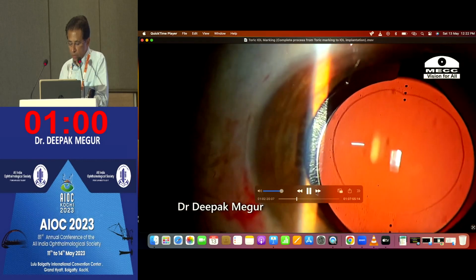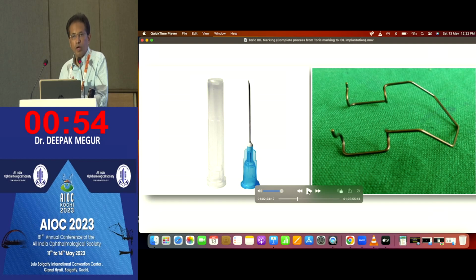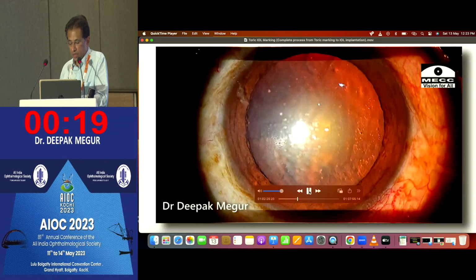The most important aspect is, in certain situations, like in patients who have myopia, who have a large bag, those are the situations where I would use a CTR. The idea of using a CTR in these eyes which have large bags is, one thing, it stretches the bag and brings the posterior capsule forward a little bit. The adherence between the posterior surface of the lens and the capsule is much earlier and stronger, and that's the reason why the chances of lens rotation are slightly minimized. So watch out for the eyes which have bigger white to white ratios.